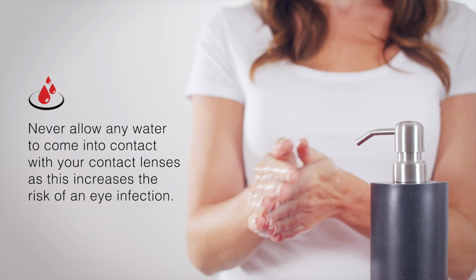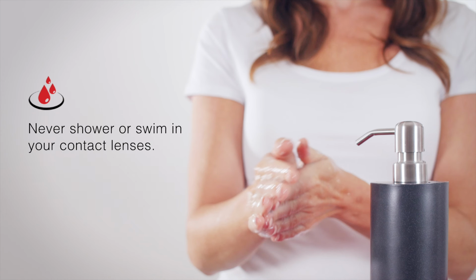Never allow any water to come into contact with your contact lenses, as this increases the risk of an eye infection. This includes showering, swimming, and other water-based activities. Now you are ready to remove your lens.